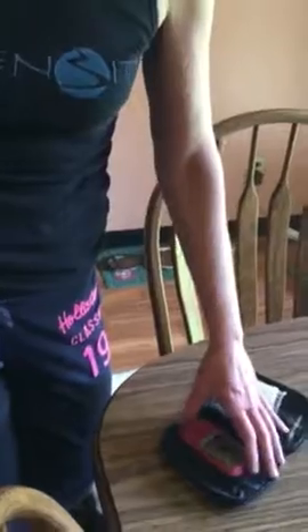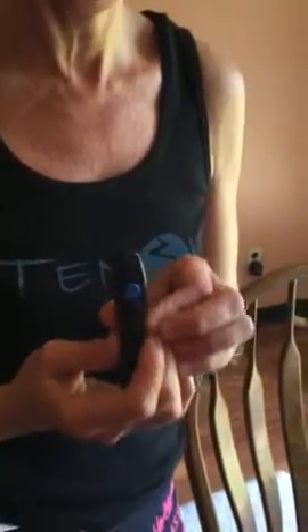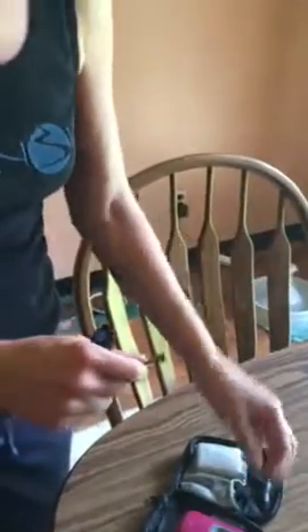I use the One Touch Delicate lancing device. I've never had any luck with the generic lancing device that comes with the ReliOn Confirm or the cheap ones you buy at Walmart. This is definitely worth the money, and I use 31-gauge lancets in it. You just take the cap off your lancing device.